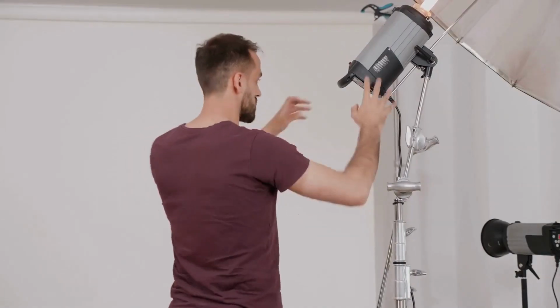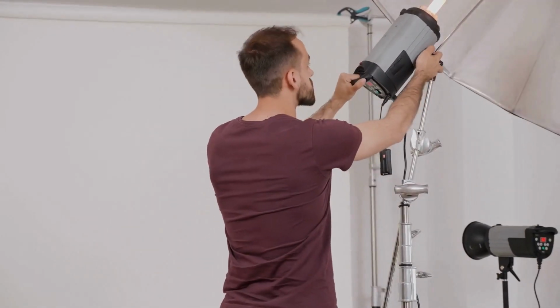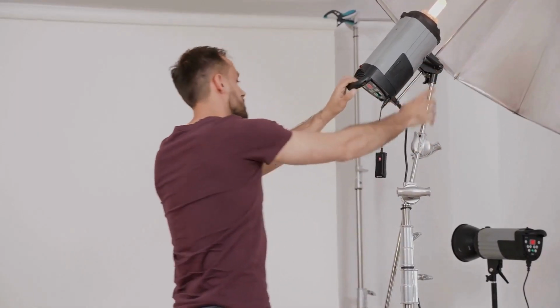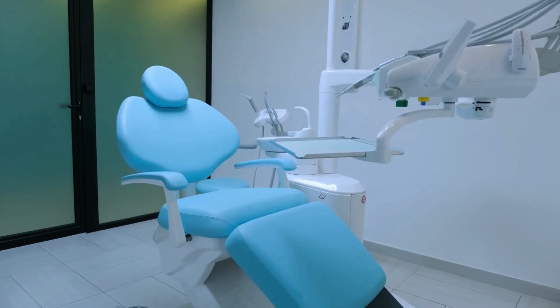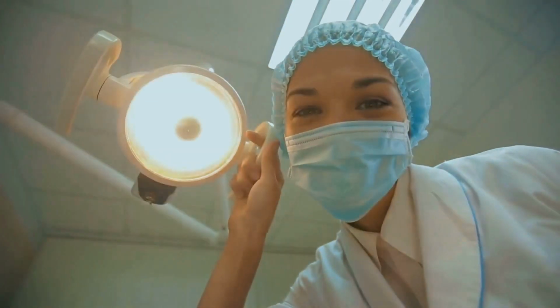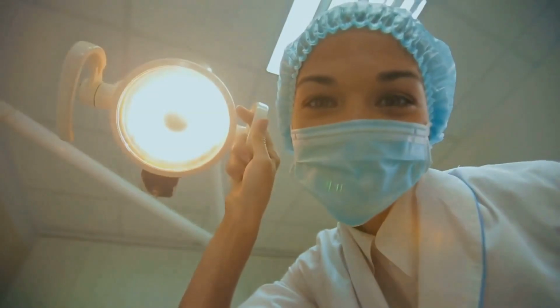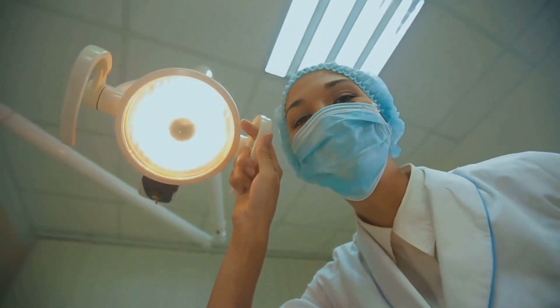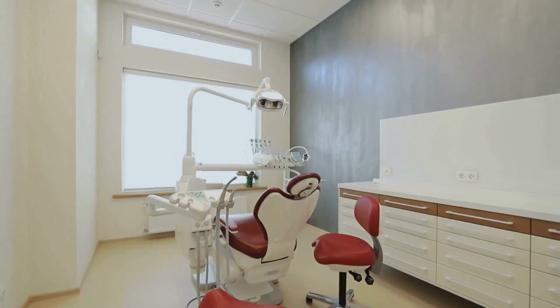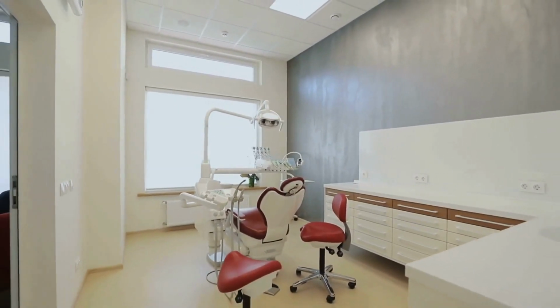Setting up a cross-polarization studio for dental photography is a relatively straightforward process, involving a few key components: a light source, a camera, and of course, polarizing filters. The light source should be powerful enough to illuminate the oral cavity effectively, and it should be equipped with a polarizing filter that can be easily rotated. LED lights are a popular choice due to their high intensity, low heat emission, and long lifespan.